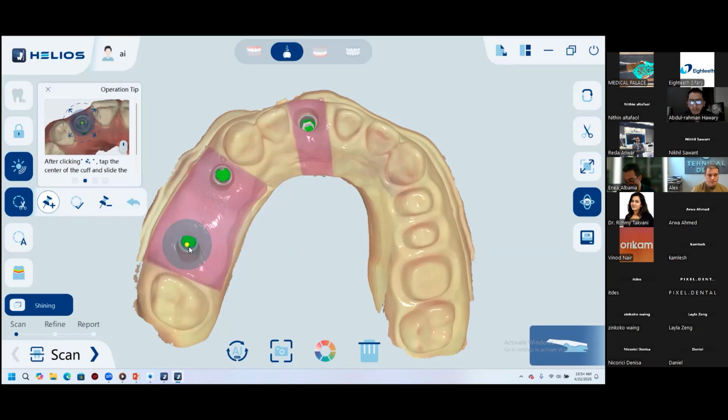So, of course, whenever you are getting a new intraoral scanner, or you're willing to buy an intraoral scanner, you need to make sure that everything that is said in the brochure is actually available within the scanner, and know how to evaluate the intraoral scanner that you're testing. So thank you, Dr. Remy, very much for the informative information that you just supplied us with. Pleasure is always mine. Yeah, thank you.